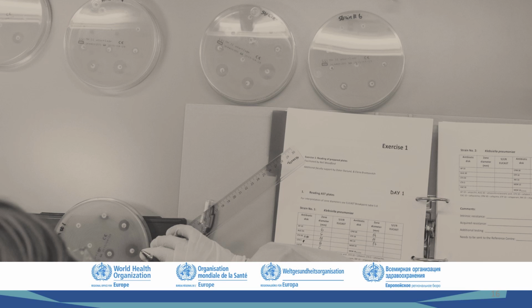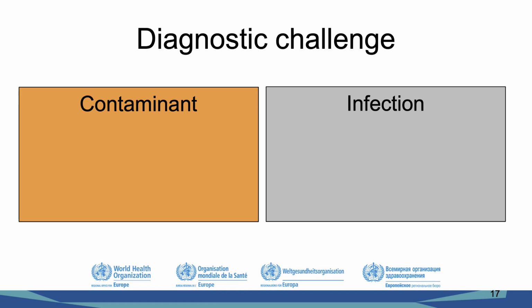Staphylococcus or Staph epidermidis and other coagulase-negative staphylococci are common skin commensals and are also frequent blood culture contaminants. Among patients with blood cultures positive for coagulase-negative staphylococcus, the majority will be contaminants. Bacteria from the skin of the patient or the healthcare provider contaminates the needle or enters the bottle during the process of obtaining blood for culture. When this happens, the coagulase-negative staphylococci identified in the culture are not circulating in the patient's blood, but they've been detected because of lapses in sterile technique.